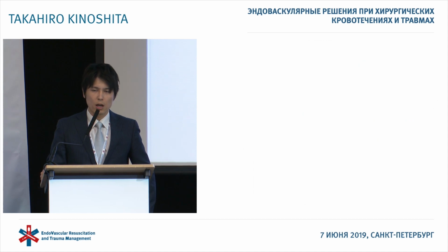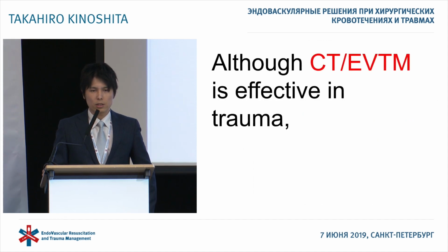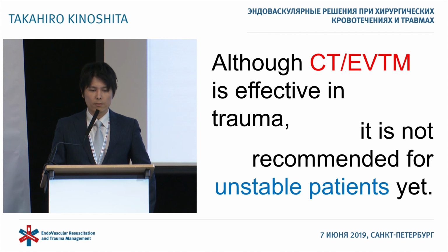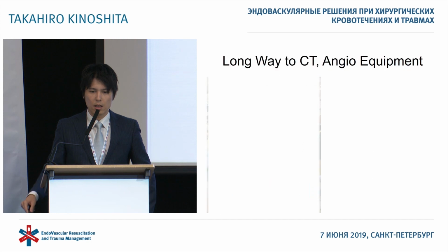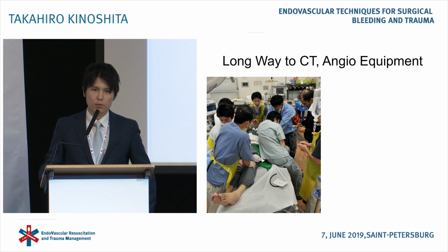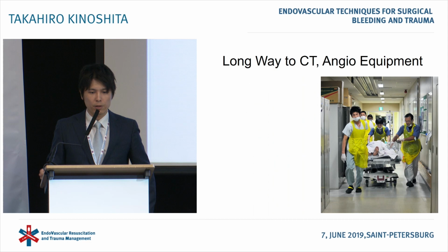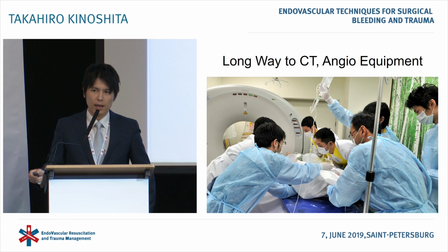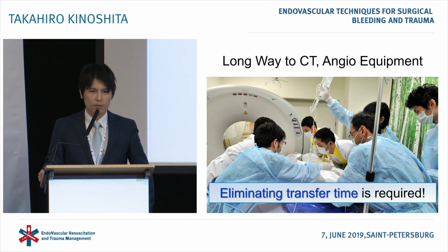So in summary, although CT scanning and interventional radiology or angioembolization are effective in trauma, they are not recommended for unstable patients yet. Why? It is partly because we have a fear of treatment delay, because if we want to use these kinds of equipment, we have to transfer the patient from the emergency room to the CT room or angio room. So we thought that eliminating transfer time is required.